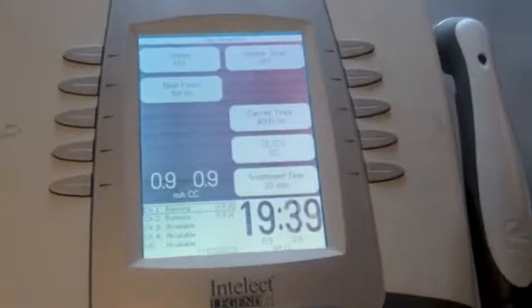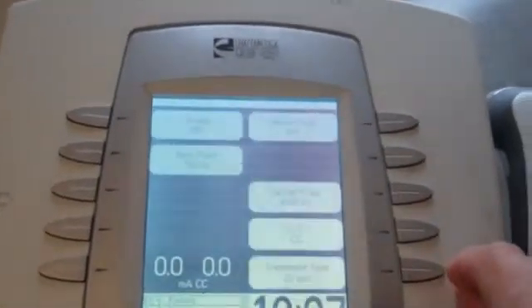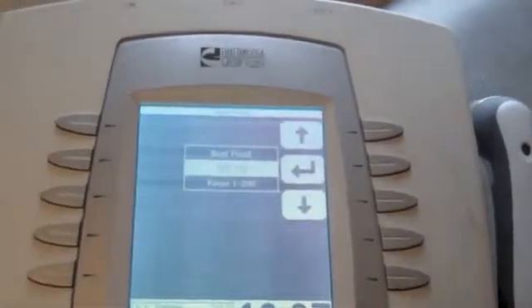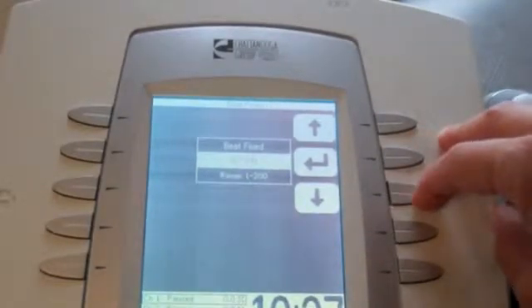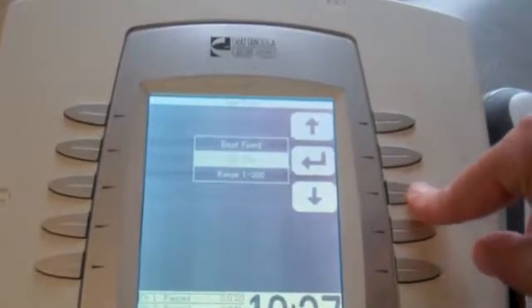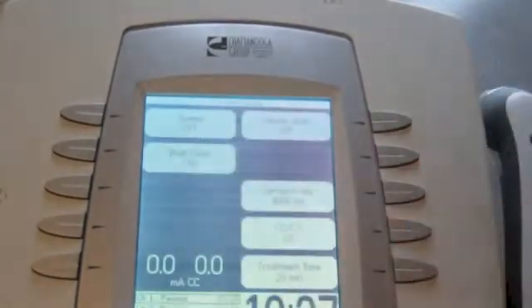So the only difference if we're doing motor level pain control, we'll pause that and go back and edit this, would be our beat frequency is what we're interested in. So our beat frequency for motor level pain control needs to be between 1 and 5 hertz, and right now it's set at 100, so we're going to bring it way down so that it's between that value. So we get about 3 hertz there, and we'll bring it back to our screen.